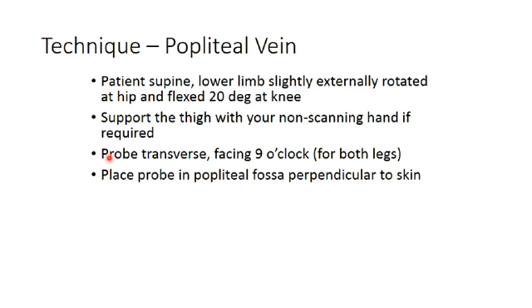And normally you can just immediately see the popliteal vein, and if you can't see the popliteal vein, you can see the popliteal artery. It might be because you're already compressing the vein because of the weight of the leg falling on the probe. So you might have to just withdraw the probe hand a little bit, and immediately the vein will come into view. If the artery and the vein don't come in view, you might again have to move the probe up and down a little bit in the popliteal fossa till you see the vein and the artery.